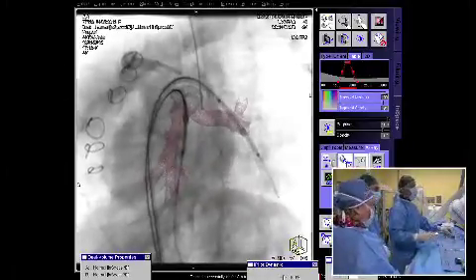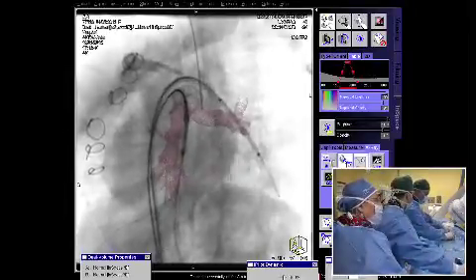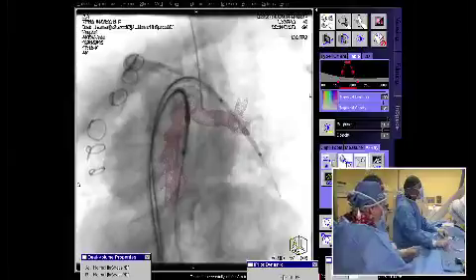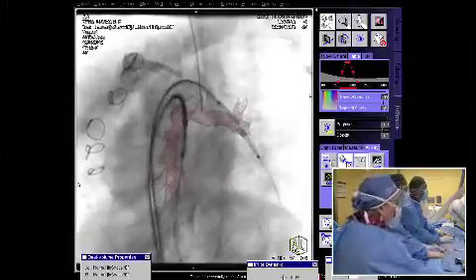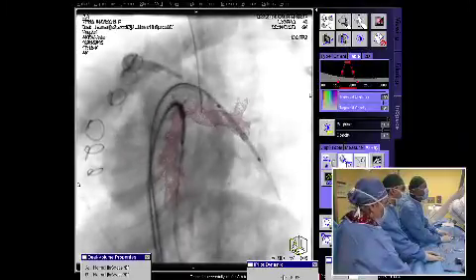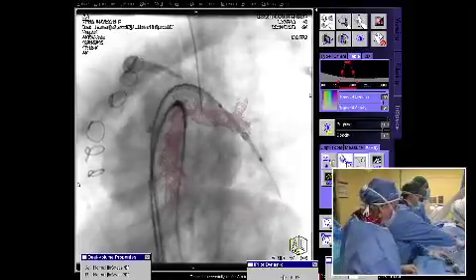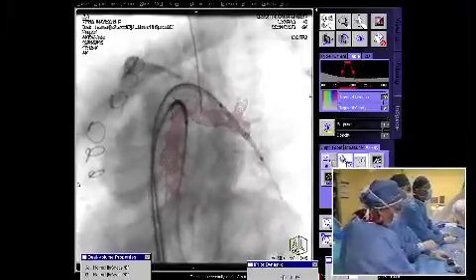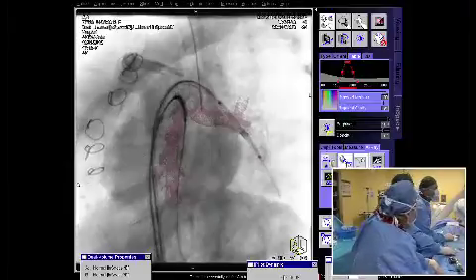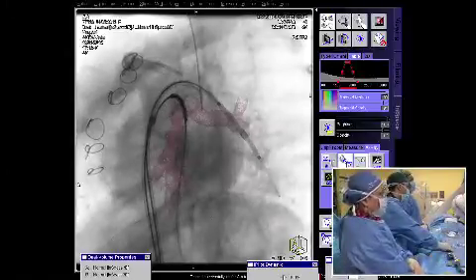Well, what do you think? Gianfranco, a comment from Gregor. You were being very polite to Gregor, saying the roadmap helps a bit. If you're doing an intervention, trying to position stents, this is a very good example of where the road mapping is a distraction, if anything, because I bet you in your head you're ignoring the road map and just looking at the stents. Yeah, that's right. To some extent, I agree with Jacques. Be careful about the pictures, try not to be confused. We'll rely on a conventional test angiography that we are familiar with under cases, and that's okay. So yeah, carry on, Gianfranco.